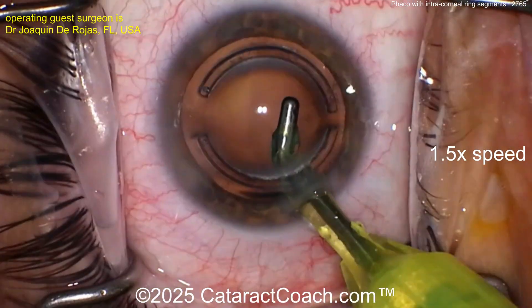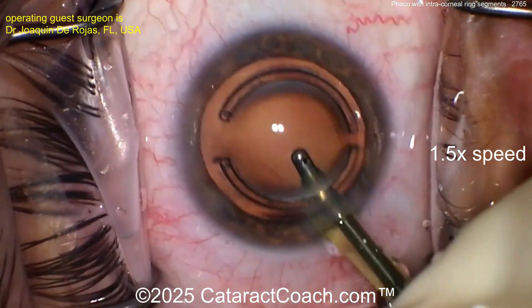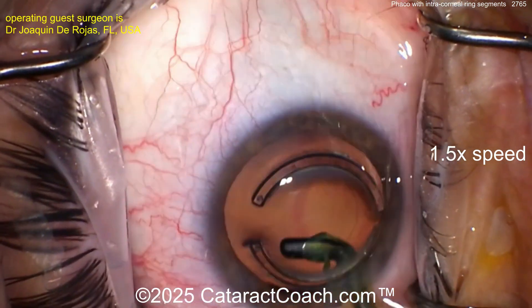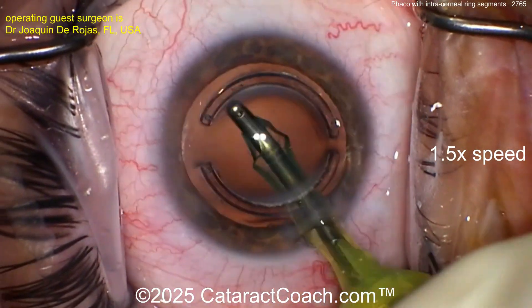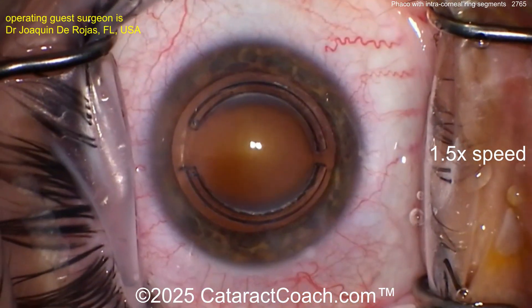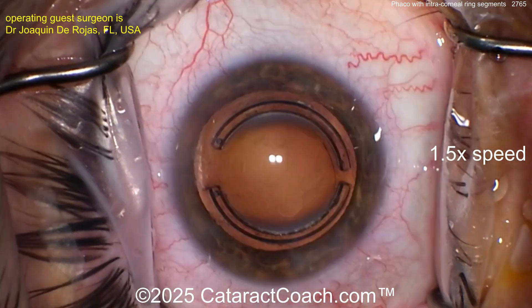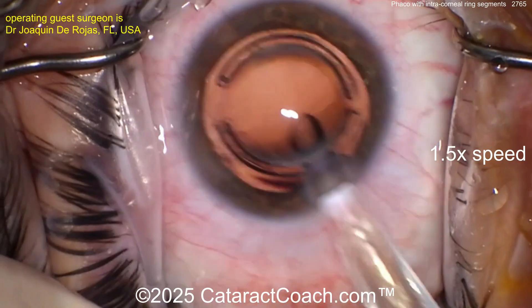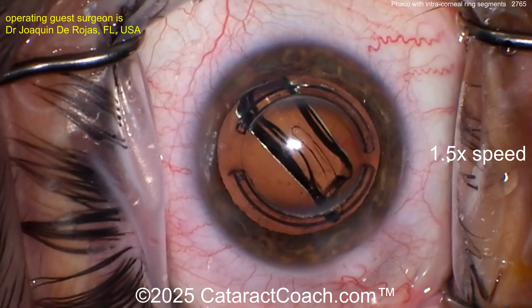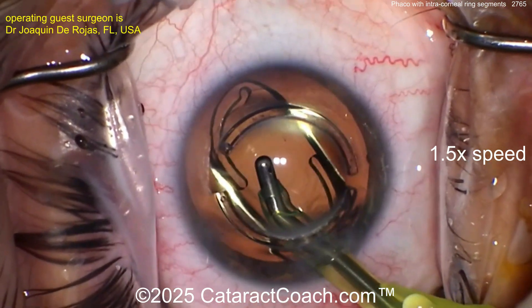The capsular bag cleans up very nicely — looks fantastic. Just about ready to place the IOL in the capsular bag. Dr. de Rojas is a very successful, high-volume surgeon doing great things. His only job after training has been working for a private equity group, and he's done very well. Here comes the IOL going into the capsular bag, nicely delivered and unfolding very nicely and in a controlled manner.